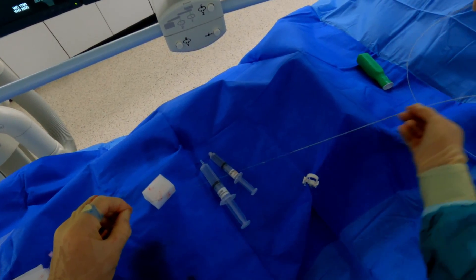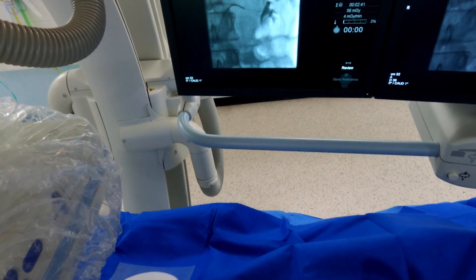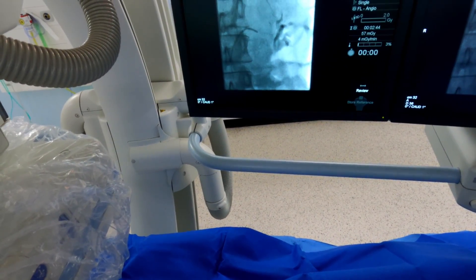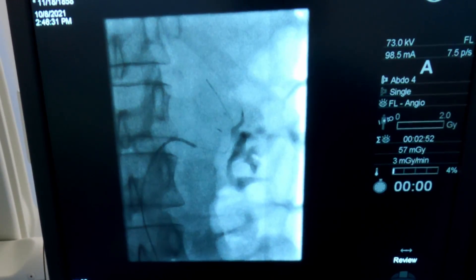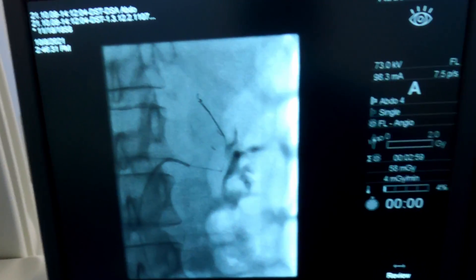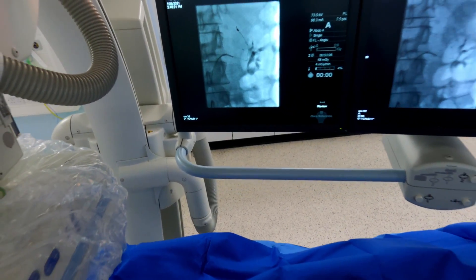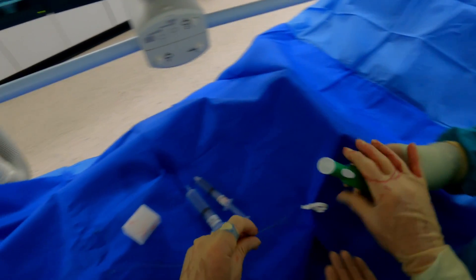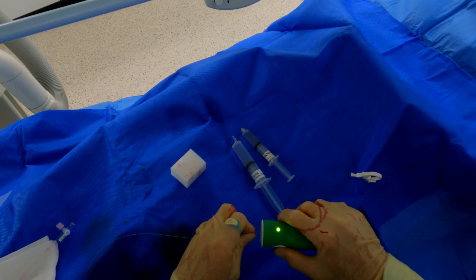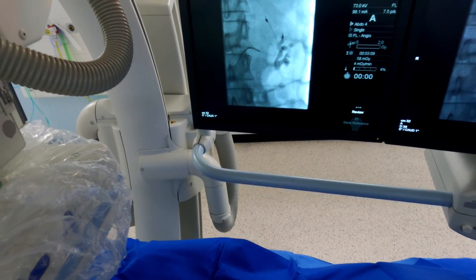Now you can take the plastic sheath off and I'll advance the coil the rest of the way. I'm advancing this with small movements so I don't kink the pusher — and you'll see it because they're very radio-opaque. There it goes. I'm just going to tap it out the end with little tapping movements, and that is it deployed. Now we need to detach it — pop that on there, it goes green with one press, and then goes green again — that's it detached. We're going to check, just in case there's a problem with detachment — we don't want to pull the coil out — and that's out fine.